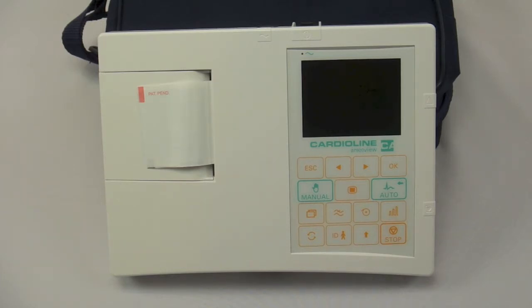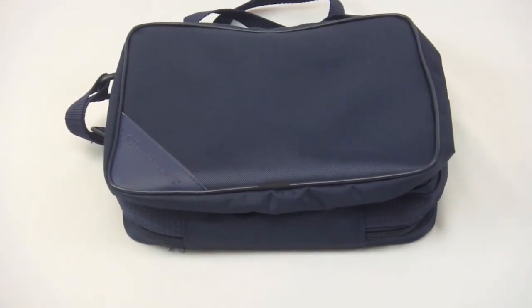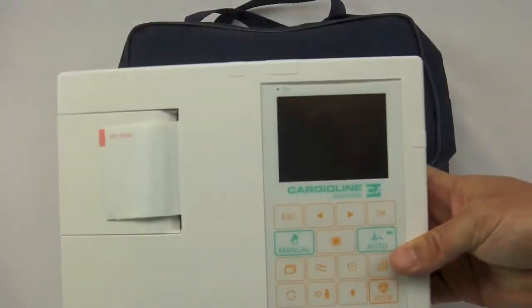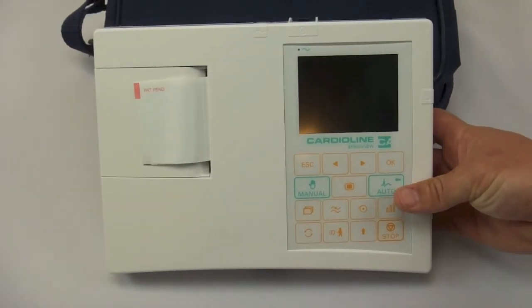The unit ships with interpretation, internal memory, and the optional Cube software for PC archiving and real-time transmission. It also features a handy carry bag at no charge where you can store your patient cable and any additional items you would like to transport with the machine. It is quite handy. The machine comes patient-ready out of the box with all of the accessories you need to take an EKG.